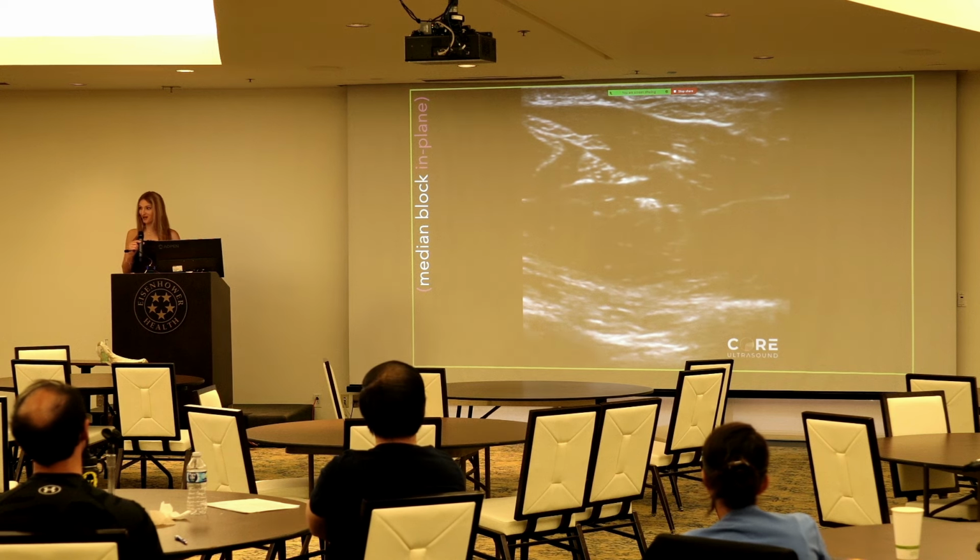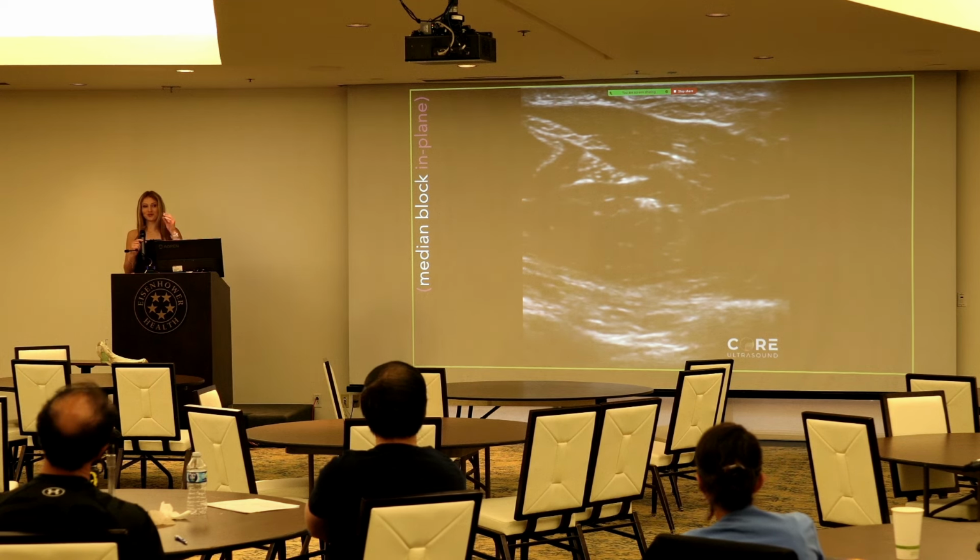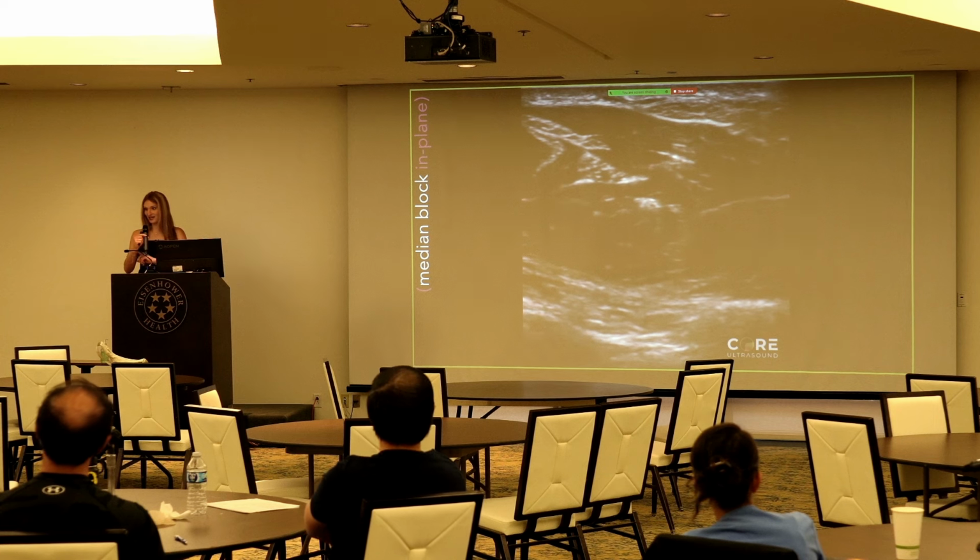This block, the median block, was the only one that hurt because he went through one of my tendons inadvertently. Because we have a lot of strong tendons laterally, that's another reason why, if I'm going to go laterally, I actually bring my transducer. I'm going to put my mic down for one second. Hopefully you can still hear me, I'll talk loud.